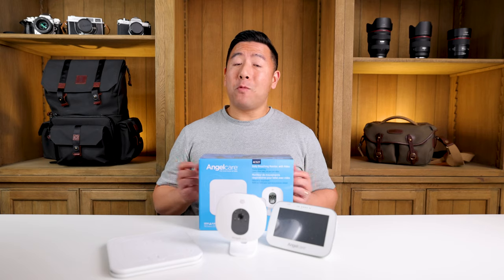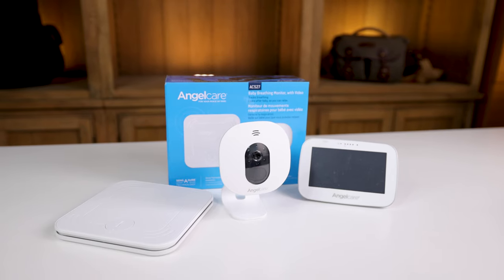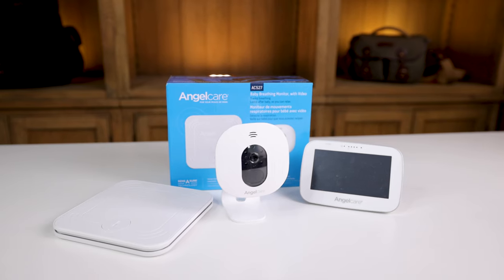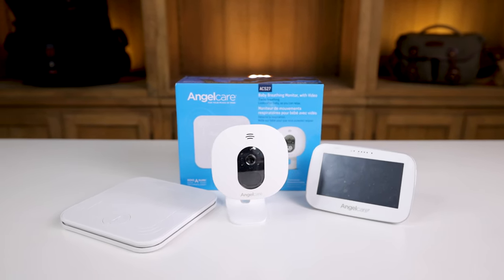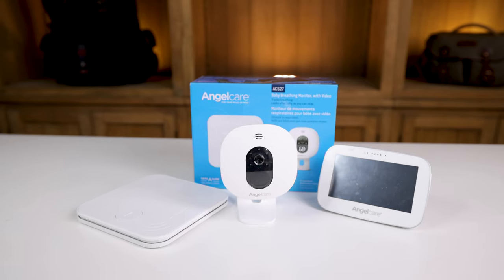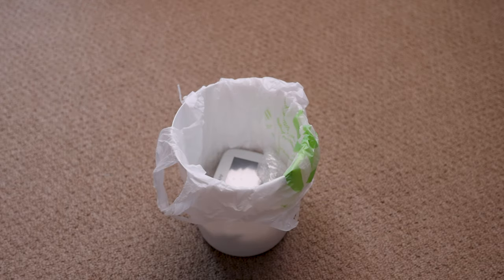Hey everyone, it's Desi Chang and today we're going to be talking about the Angel Care Baby Breathing Monitor. Although it works 100% fine in terms of monitoring your baby's breathing, it sucks at everything else.